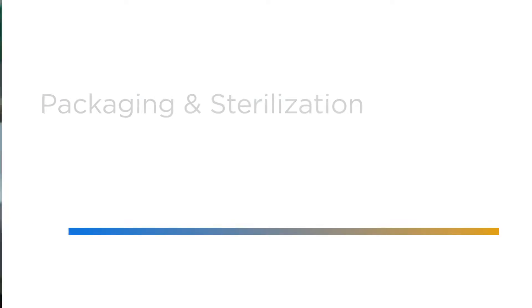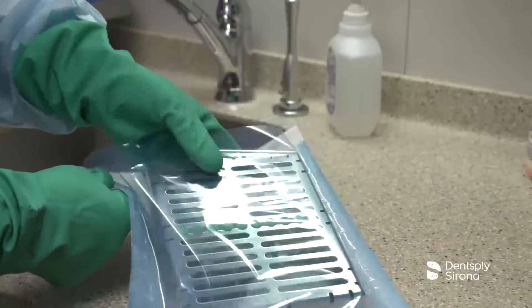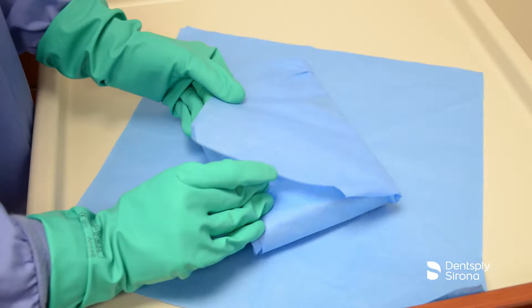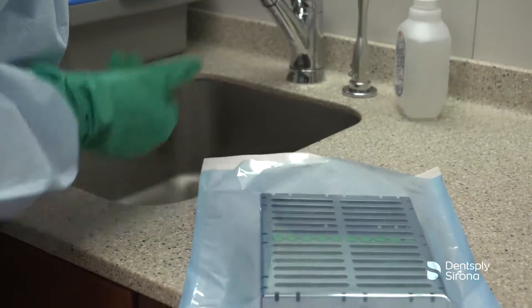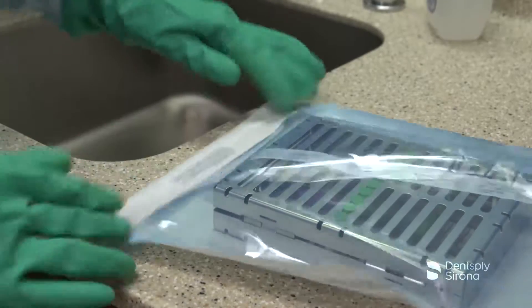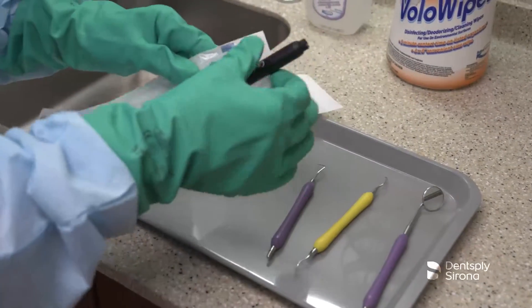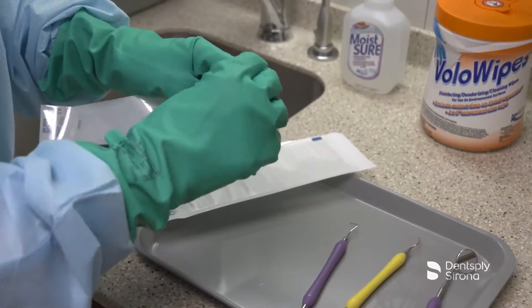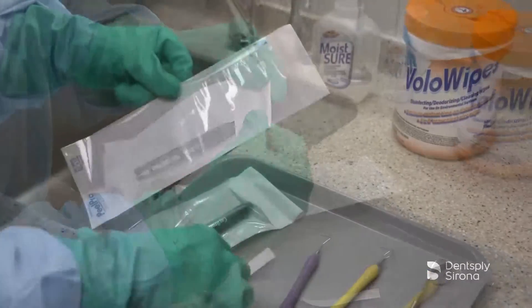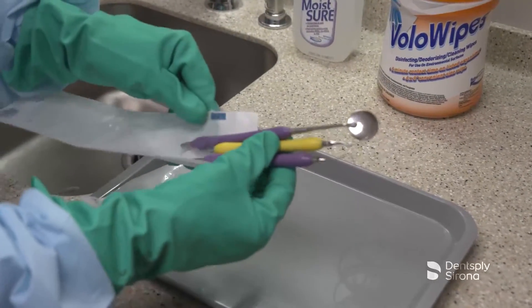If utilizing cassettes for inserts or hand instruments, place the cassette in a paper-to-plastic steam sterilization pouch or a sterilization wrap after ensuring the instruments are completely dry. After following the handpiece manufacturer's recommended cleaning and disinfecting guidelines, handpieces should be packaged in a sterilization paper-to-plastic pouch. If cassettes are not an option, place the instruments and inserts in a paper-to-plastic sterilization pouch.